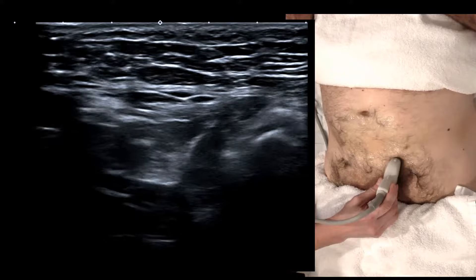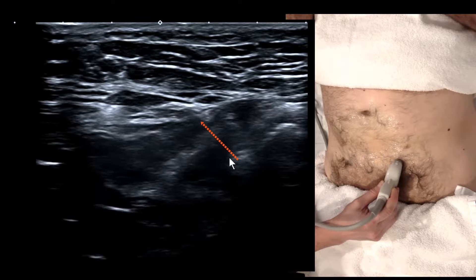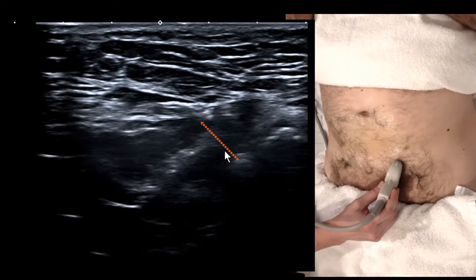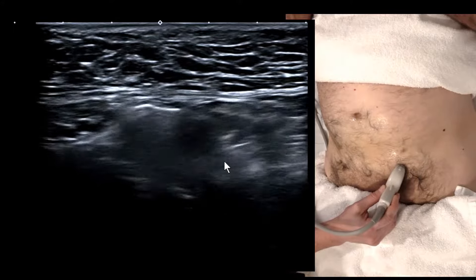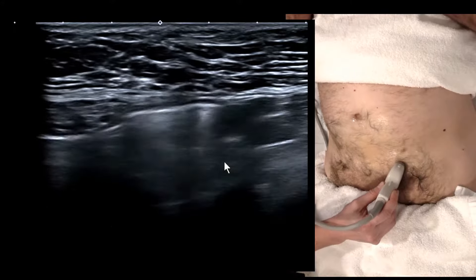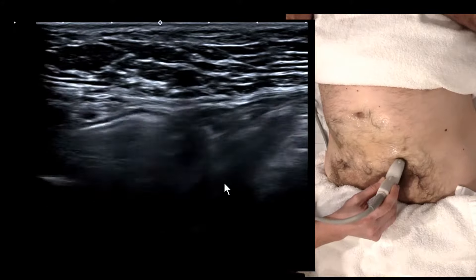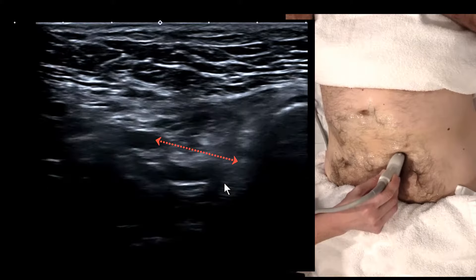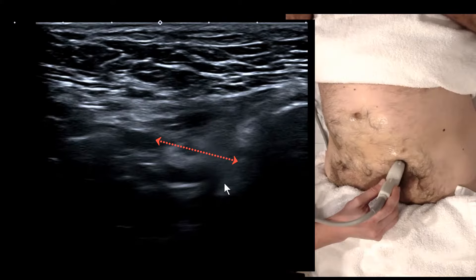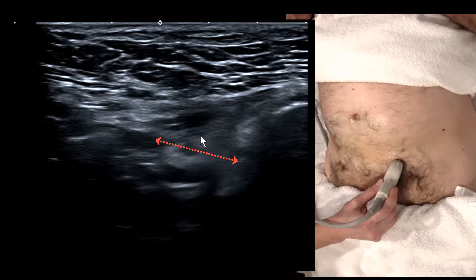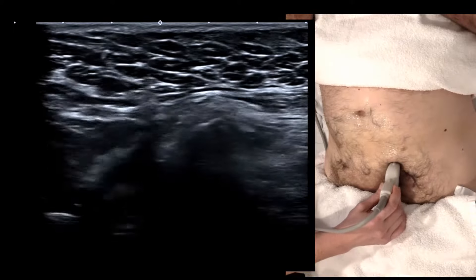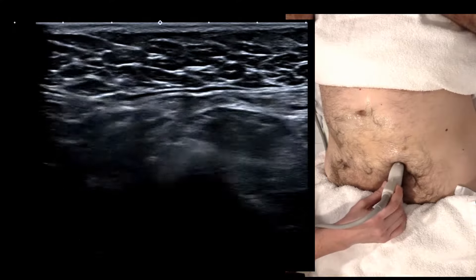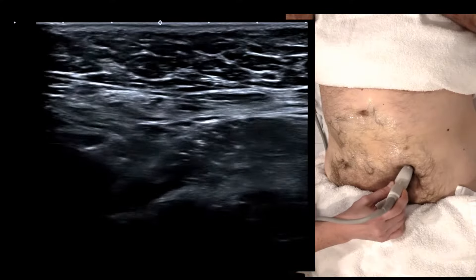If the hernia looks like it's coming straight up at the camera, do a really gentle push, then relax and push it back in. If it's coming straight up at the transducer, it's definitely a direct hernia. To look for an indirect hernia, we need to find the spermatic cord, which is a little bit more lateral.